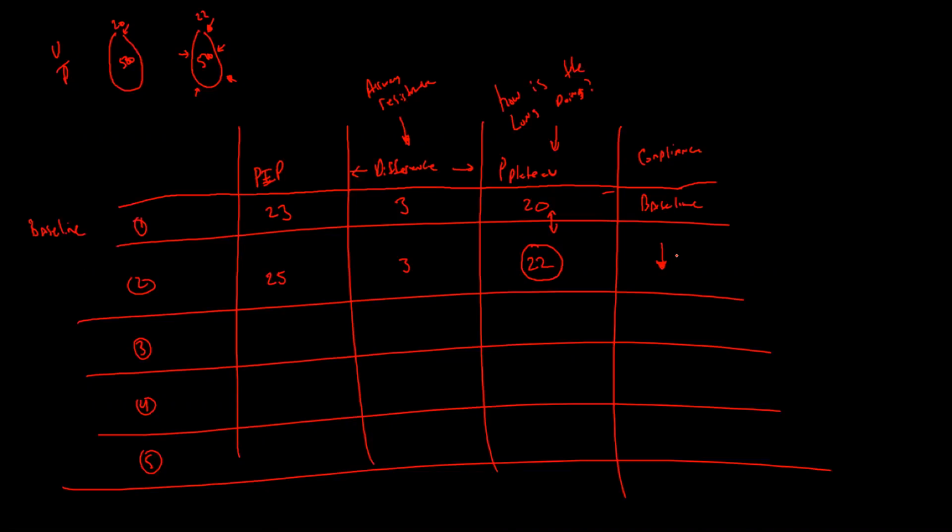It's that one that has all the different increase, decrease. Which would be completely fine because you don't have to have numbers here. You can just see, okay, plateau pressure is increasing. That means the compliance is decreasing. Patient's getting sicker. Okay, so this is number one. I'm just going to put a 1 over here to the side. That's the first step that I do. I look at the plateau pressure and I compare it with the one previous. And that tells me what direction the patient's going as far as the health of their lungs.